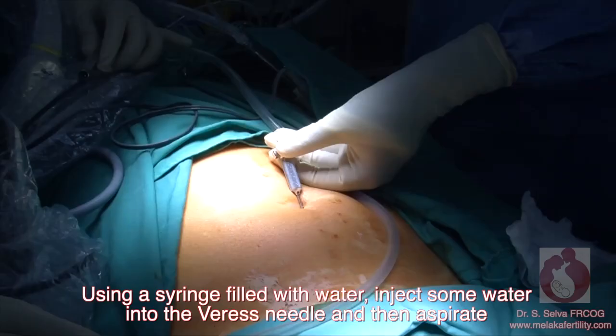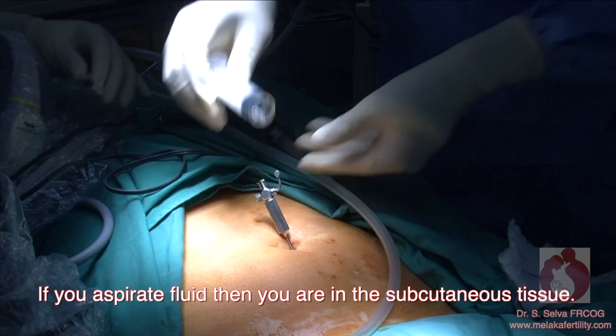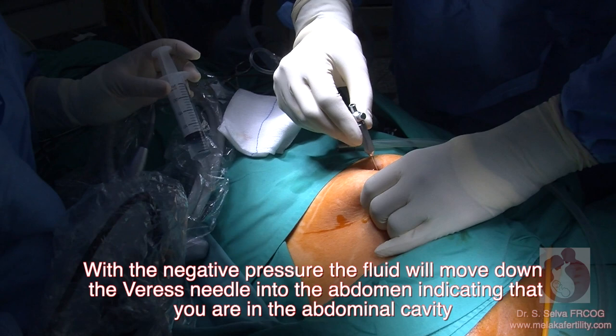Hanging drop test: using a syringe filled with water, inject some water into the Veress needle and then aspirate. If you aspirate fluid, then you are in the subcutaneous tissue. You can then place a drop of fluid on the Veress needle and pull on the abdomen. With a negative pressure, the fluid will move down the Veress needle into the abdomen, indicating that you are in the abdominal cavity.